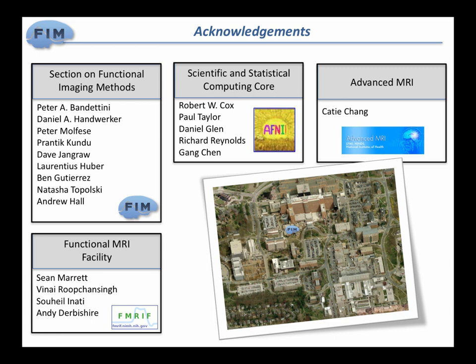But what you also have to keep in mind is that the later echoes will have almost no signal. At some point, you'll run out of signal. So it's a balance. It really depends how fast you can image, how close you can put your echoes. That's what will give you the answer. I think that 4 or 5 are easy to fit usually, and you still have signal. And I think you can do much better than with just 3.